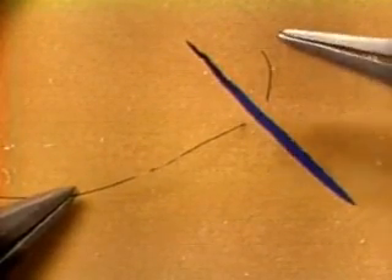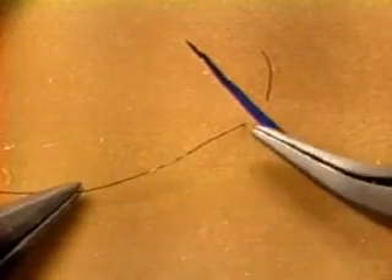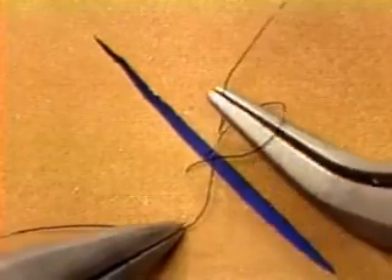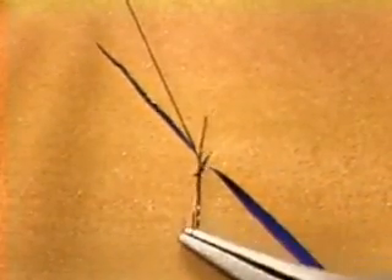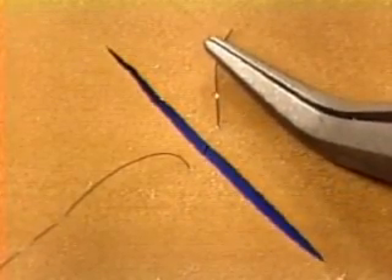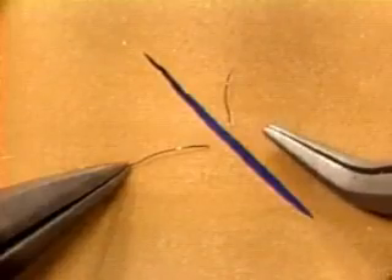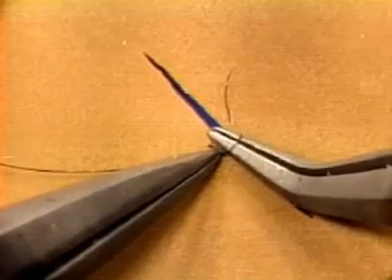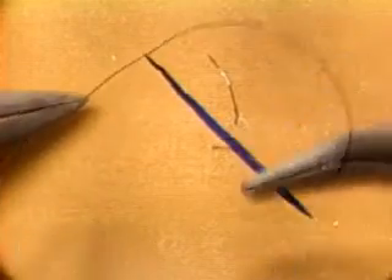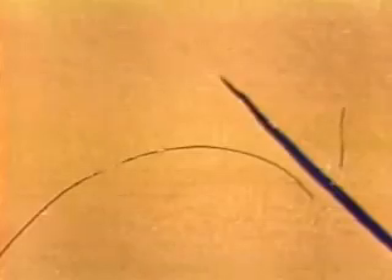Act one: picking up the thread. Be sure at the start that you have the right amount of thread on both the short end and the loop. If the short end is too short, you're likely to pull it through by mistake; if it's too long, you'll have trouble pulling it fully through the loop. Three millimeters is a good length for the short end — a little shorter than the tip of the angulated forceps. For the loop you need a length about three times as long as the short end. If the loop is too short this happens; if too long you can't work with it concisely.